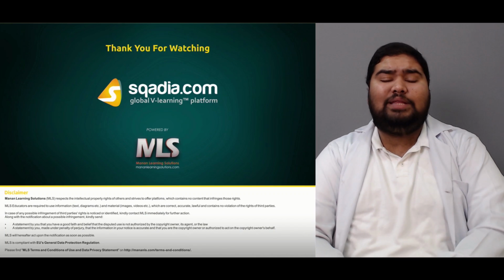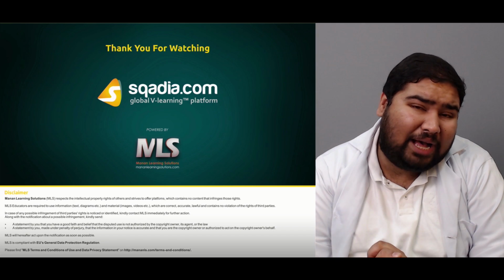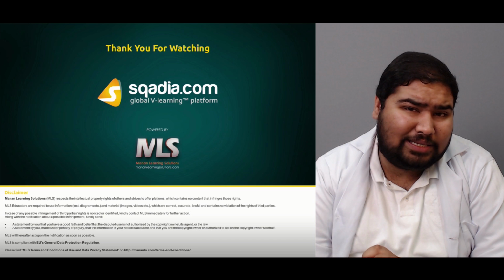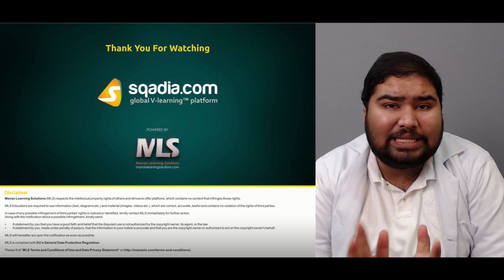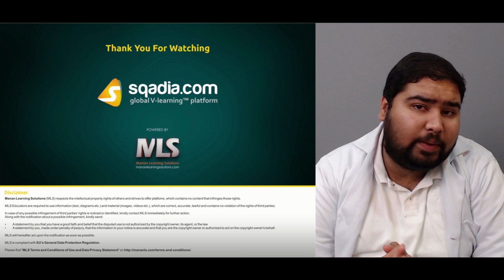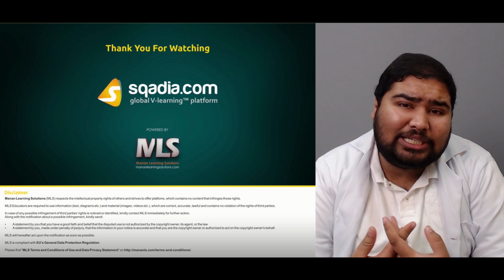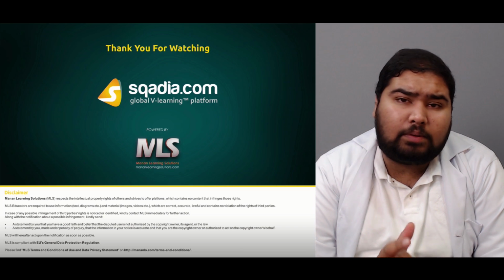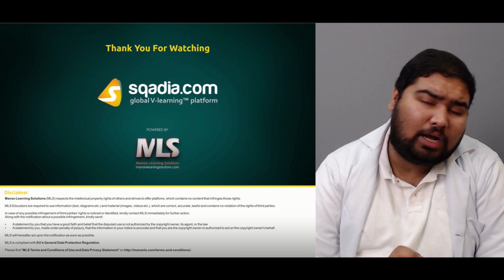So this was all about this section. In this section, we talked about the basic principles of how to gain access in laparoscopic or minimal access surgery, the most important of which was the insufflation or insertion of the trocar. Insertion of the trocar has two methods, the open and the closed method. The closed method was just direct insertion, which was blind insertion, which might cause some damage. In open method, we perform a small incision, we visualize the peritoneum and then insert the trocar. Both are important.